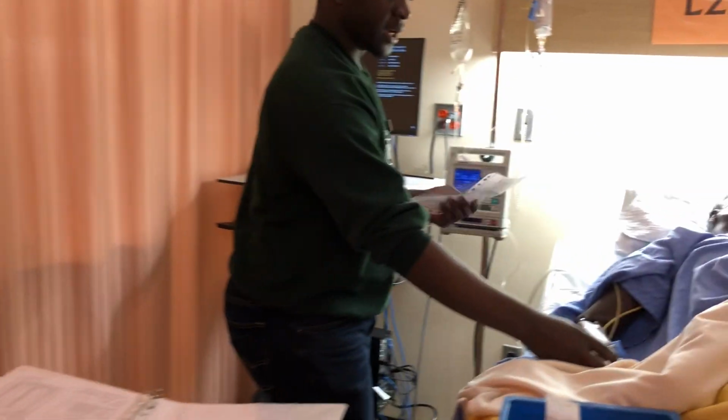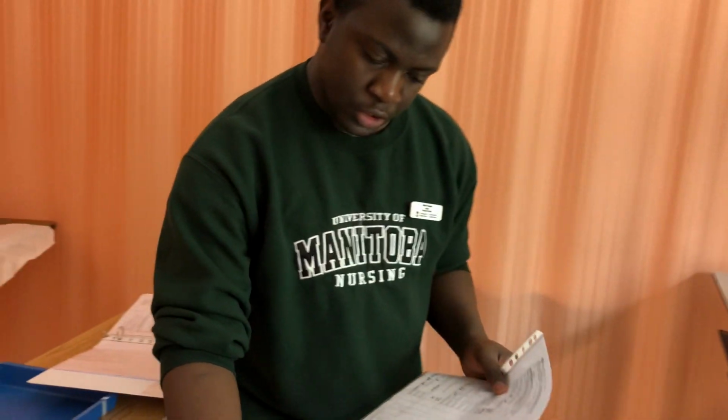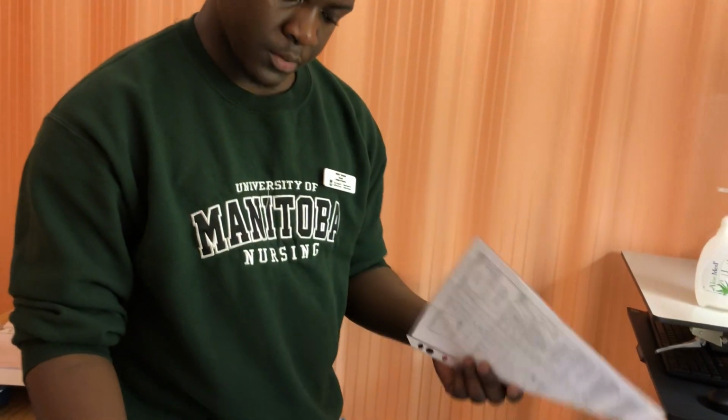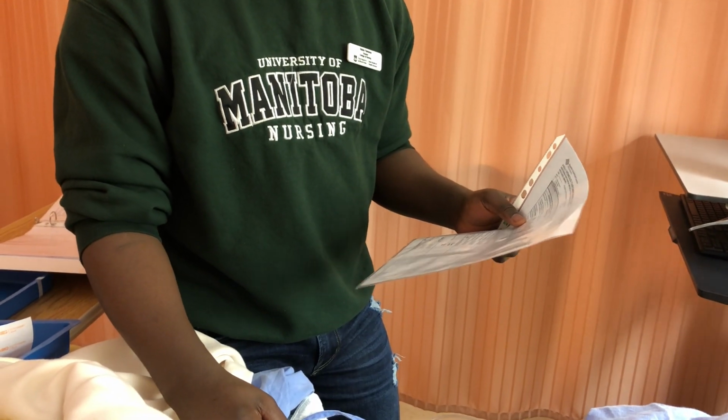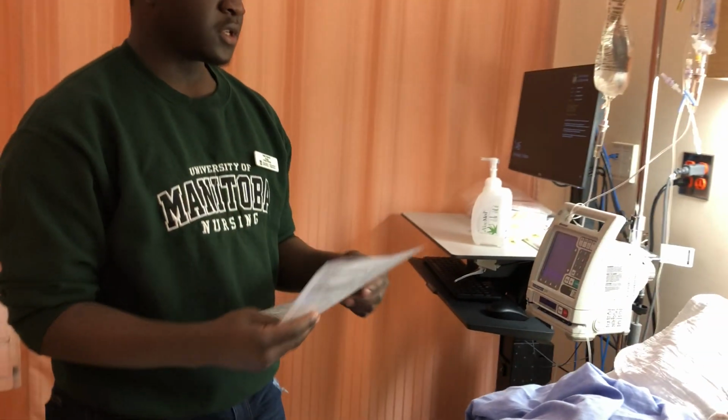So I can just take my MAR to the patient's room and double check that with the patient's IV band first to make sure I have the right patient. So Wendy Homeless, can you please tell me your name? The patient will tell me their name, and I'll double check the phone number, 1, 2, 3, 4, 5, 6, 7, 8, 9. So I'm going to be starting your heparin.